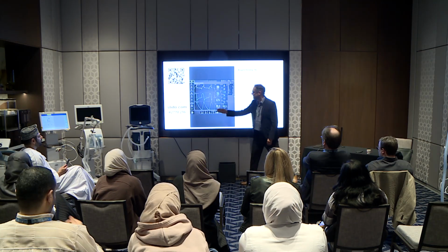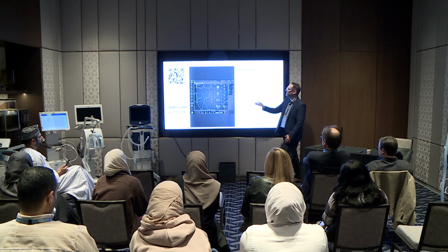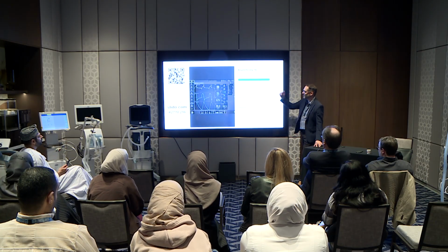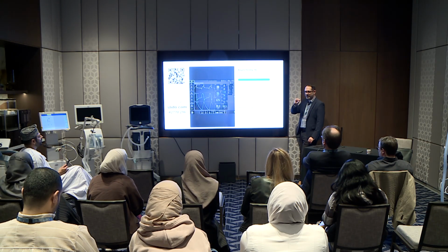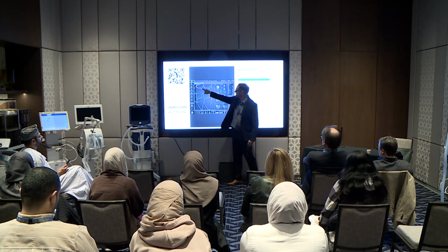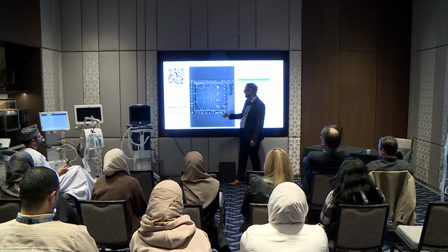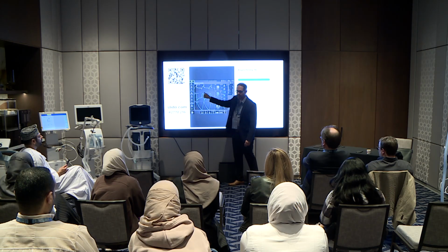Ineffective efforts: when I look through my expiratory phase, there's no evidence of clear Pmus. So, process of elimination, as we just discussed, the I time is slightly too long. Good. Always a few say auto trigger, but I hope I explained why it's not auto trigger. If the heart rate is triggering the ventilator, or anything that's auto cycling, I mean, if it's a leak, the breaths will be stacked right together. If it's due to cardiac oscillations, you probably would see some fluctuations in flow, but you definitely would not see a huge drop in pressure.